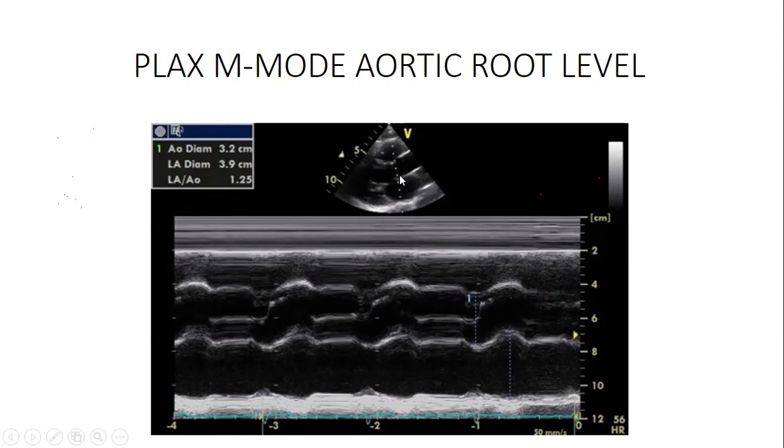Yes. And then what structure is this? According to long parasternal long axis, this is, for now, let's cram, but it will make sense, I know. And then this one, from this whole thing here, you see, the left atrium, and then this scan line is passing from there up to here. And the whole lot of this thing down here is a left atrium. Why are we having it so long? Because this is a cardiac cycle. It's repeating.